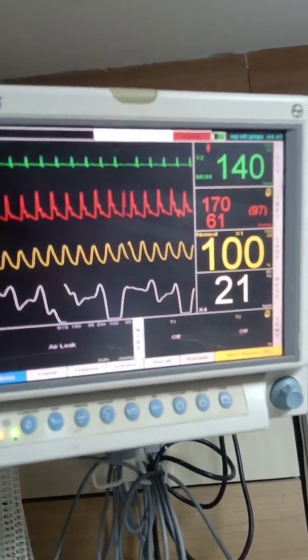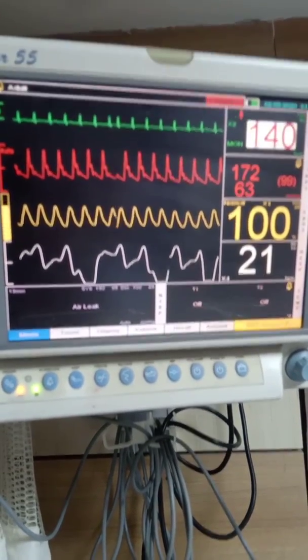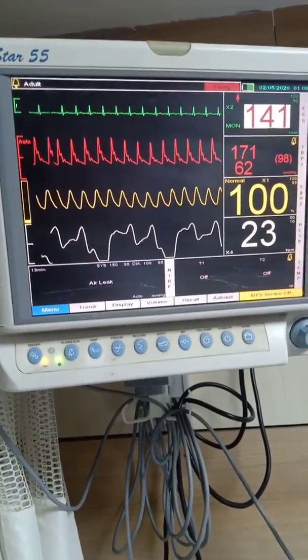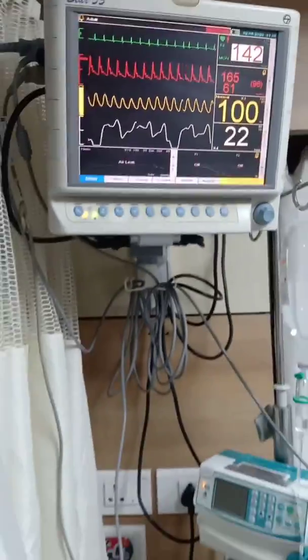We have a clear waveform showing systolic, diastolic, and mean arterial pressure. This zeroing needs to be repeated whenever the position of the transducer relative to the patient keeps changing.